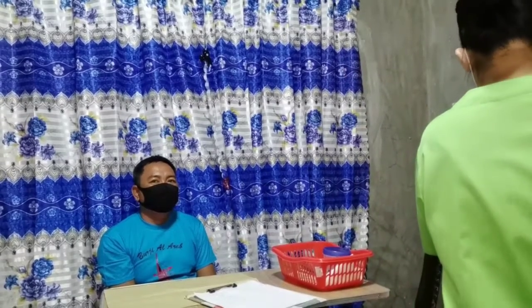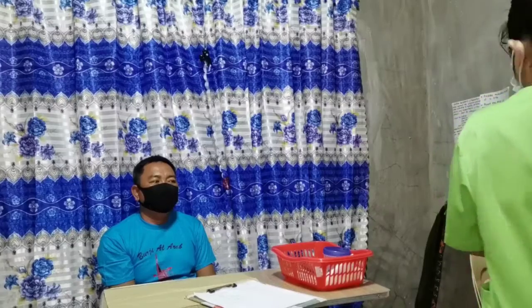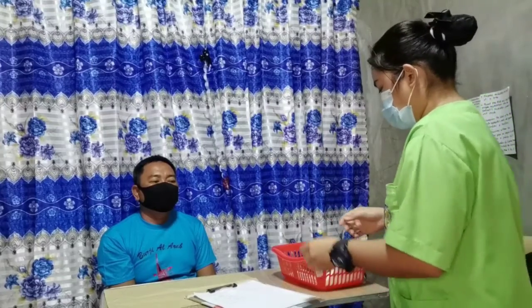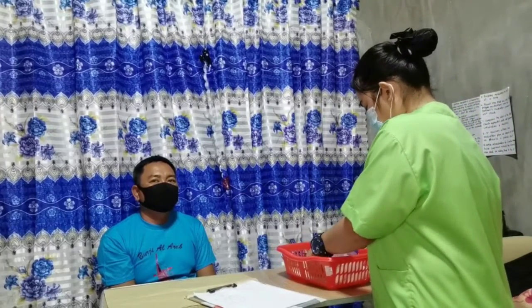Do not recap the used needle. Engage the safety shield or needle guard if present. Discard the needle and syringe in the appropriate receptacle. Assist the patient to a position of comfort. Remove gloves and dispose of them properly. Perform hand hygiene.